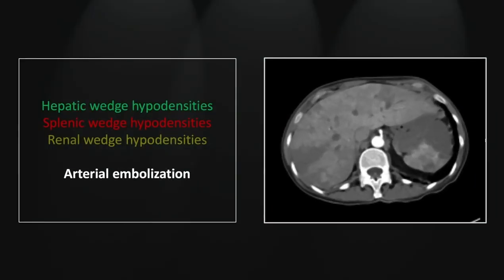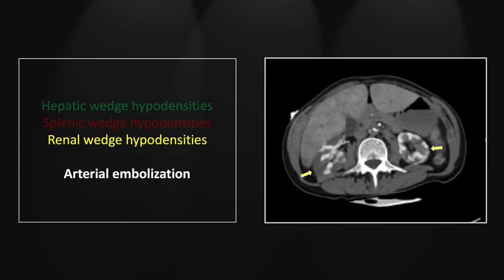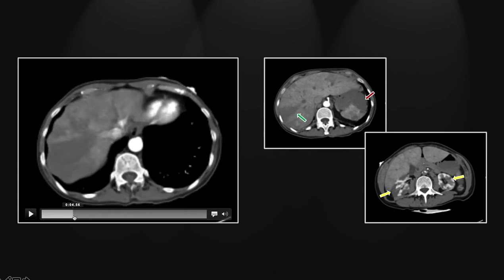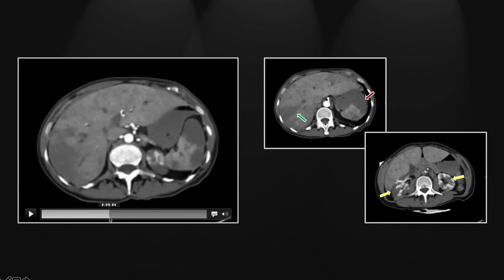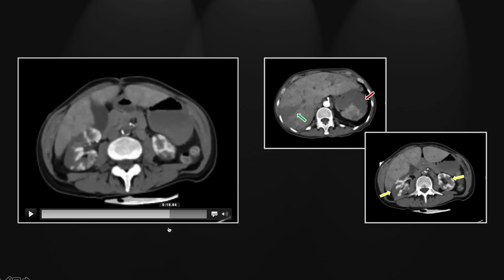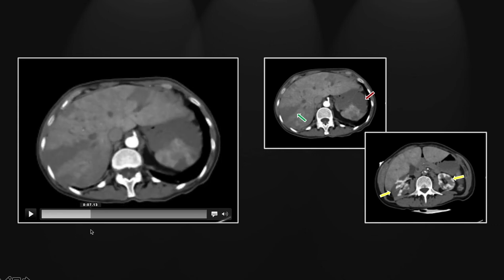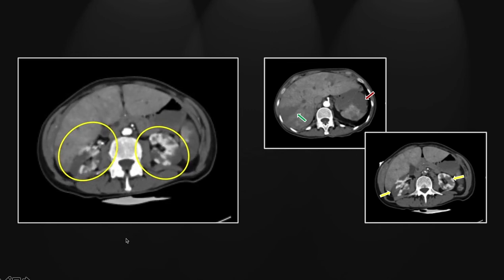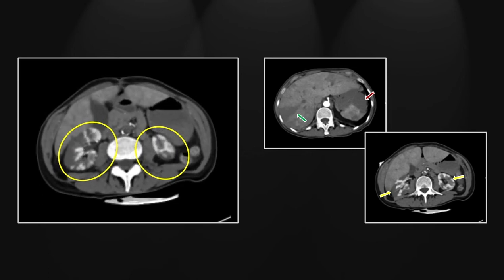Our next case is an extensive arterial embolization involving all of the parenchymal organs. The liver and the spleen both show wedge-shaped hypodensities that are very well circumscribed and typical in appearance for infarcts. Look at the kidneys — they have extensive wedge-shaped hypodensities, very well circumscribed, and consistent with an embolic shower. Let's first appreciate the extensive hepatic infarcts. Note also the anterior spleen, clearly infarcted. The kidneys show multifocal wedge-shaped cortical hypodensities, clearly denoting an embolic shower.